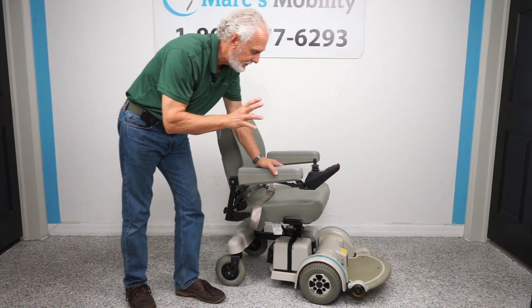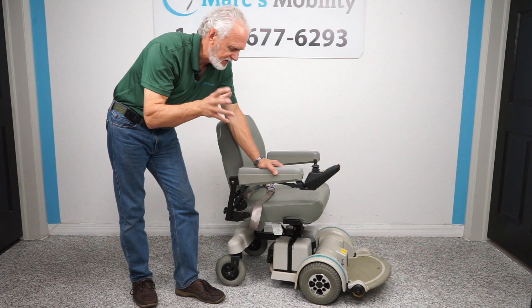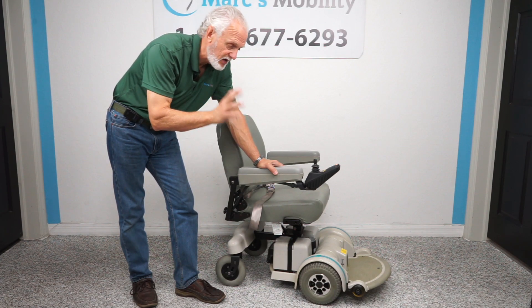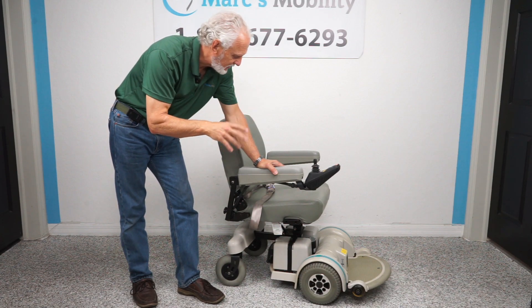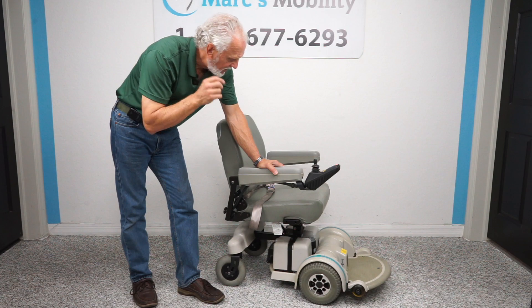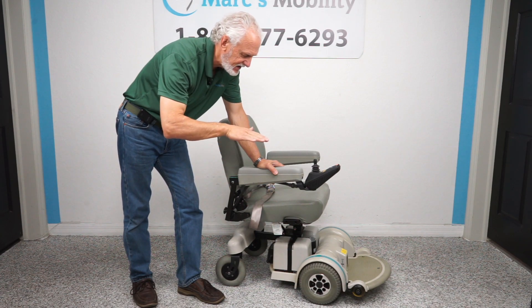This chair has a 300-pound weight capability and will run about 15 miles on a battery charge. That 15 miles is under perfect conditions — if you're outside going fast in the grass you won't get 15 miles, but it's going to run all day long.